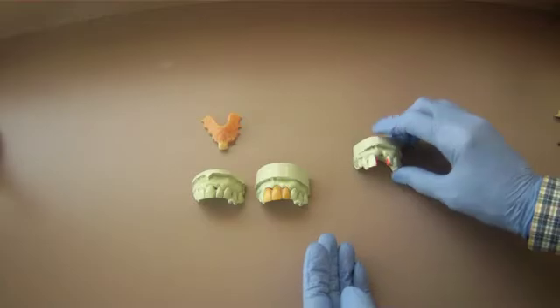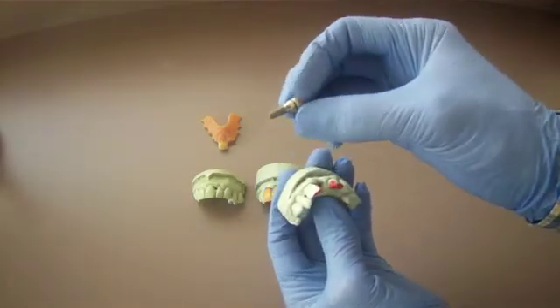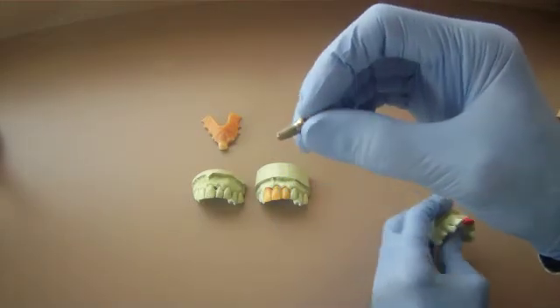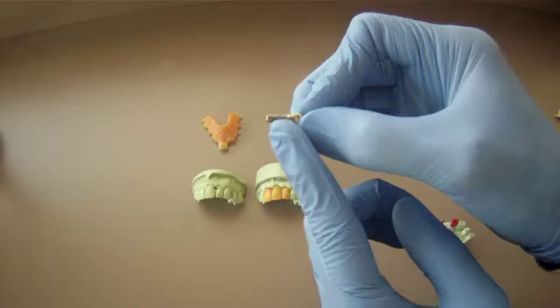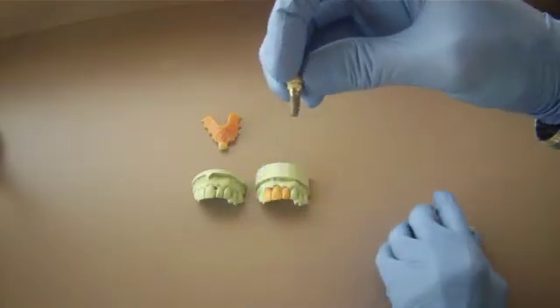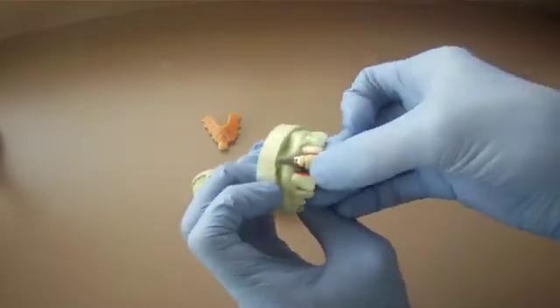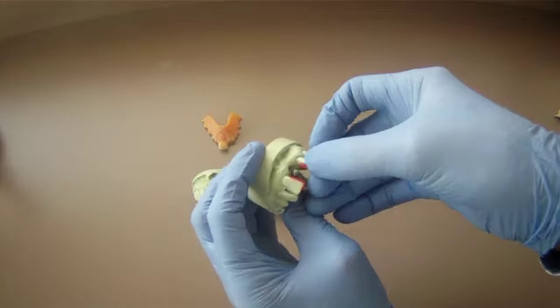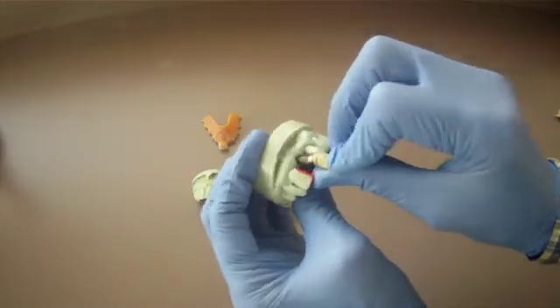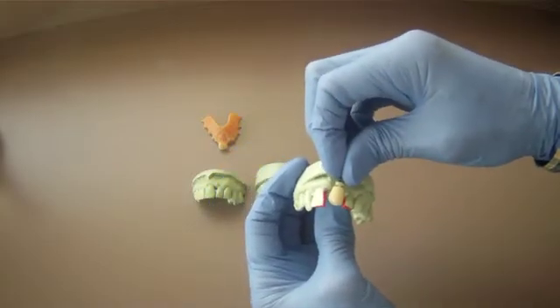The other alternative is to construct what they call the new, so-called modern way of doing this, with a titanium post. These are called dental implants. This titanium post goes deep into the jawbone in this kind of a fashion so that it's adhered to the bone, and then the crown obviously would be about here.